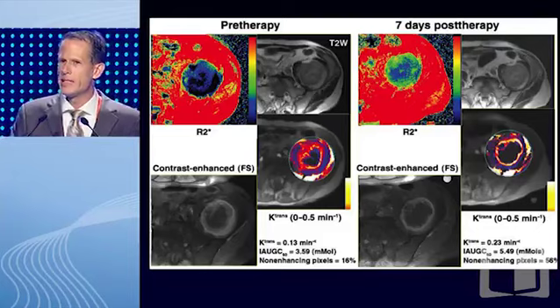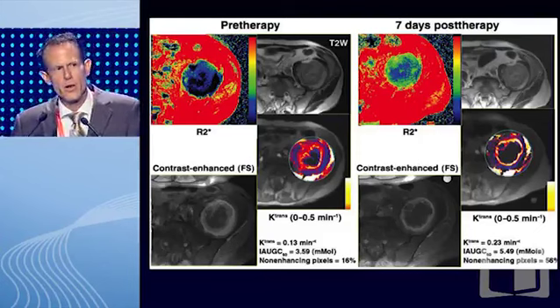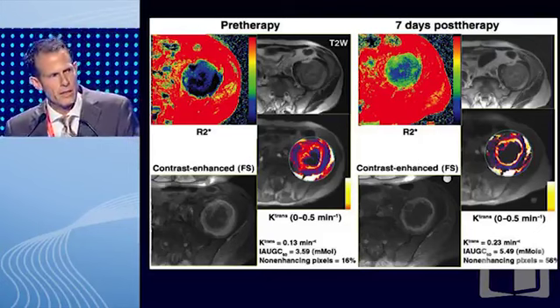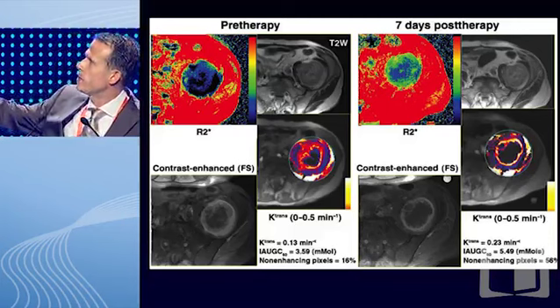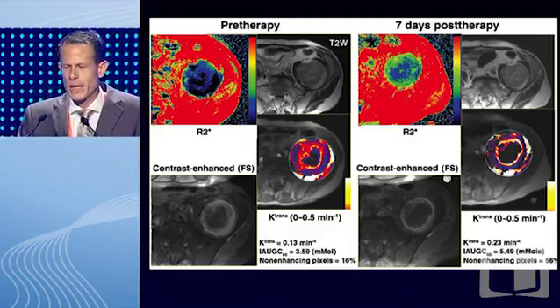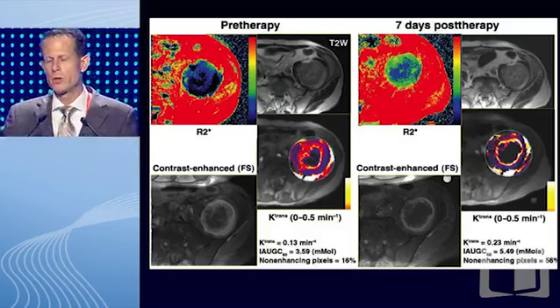And the next slide should just underline that it's not really simple, it's not easy, not everyone can do it. So here we deal with a large metastasis of a rectal cancer. The metastasis is in the soft tissue of the left iliac side. And you see on the left side the situation pre-therapy. It is color-coded, so you can translate your perfusion values into colors. And on the right-hand side, you have the status 7 days post-therapy, and you can nicely see that the colors change. So tumor biology changes. Perfusion can assess this.